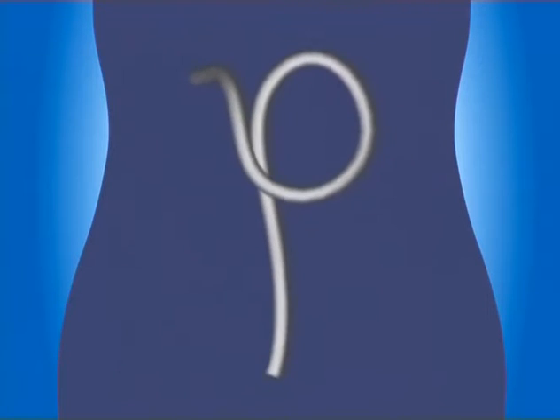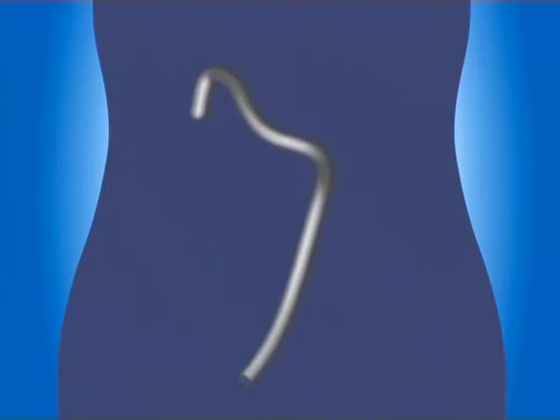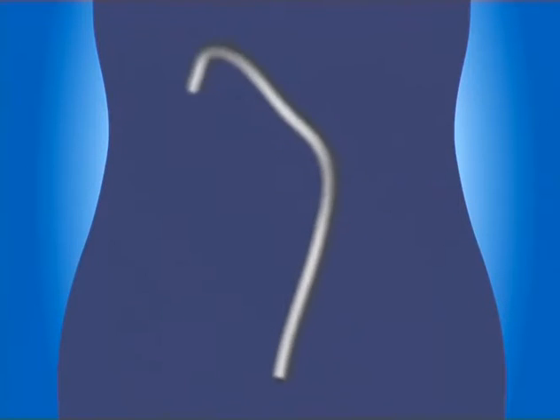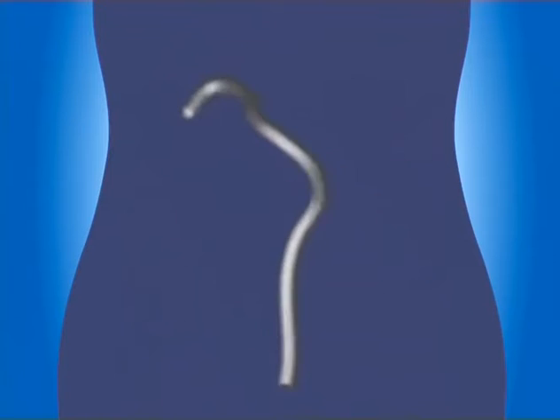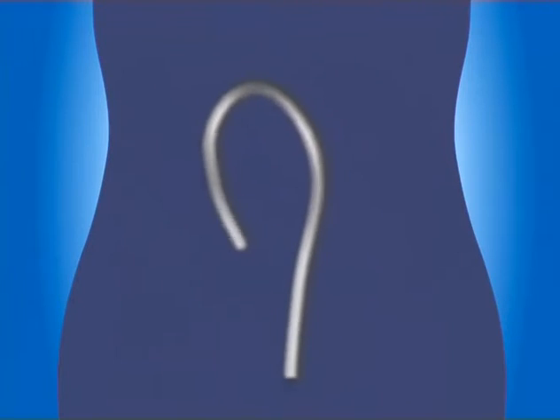This is now 45 minutes after the particular endoscopist started this procedure. Follow the gyrations of the scope and the colon until eventually the cecum is reached. And typically of such long colons, and this is the point, the bowel can be pulled back and shortened to only 60 centimeters. This colon is clearly very mobile.